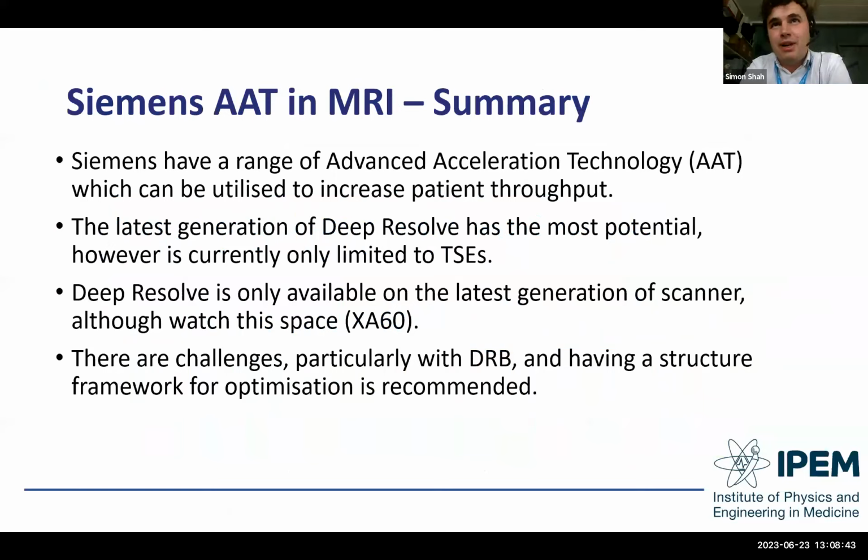The Deep Resolve is only available in the latest generation of scanners, which is a bit of a problem as well. But watch this space. When XA60 comes out, it will be available on the Skyras and the Eras. So it is coming, it will take time, but it will then be beneficial for sites who have already installed these scanners and are not planning to replace them in the next 5 to 10 years.